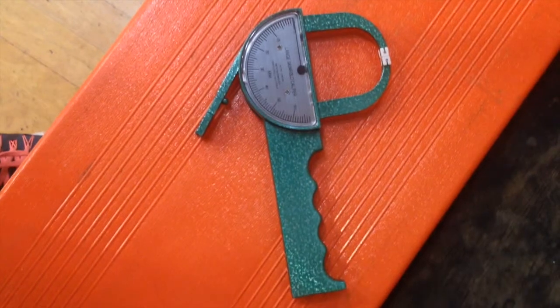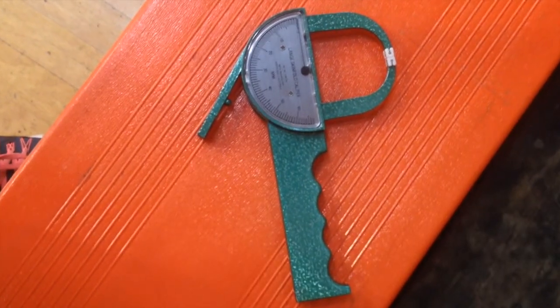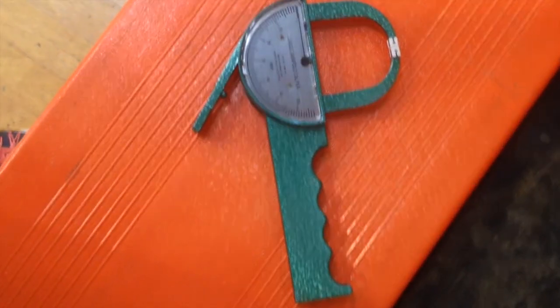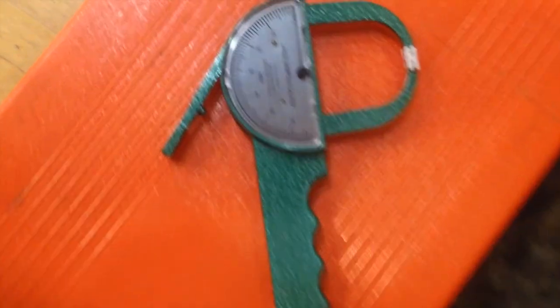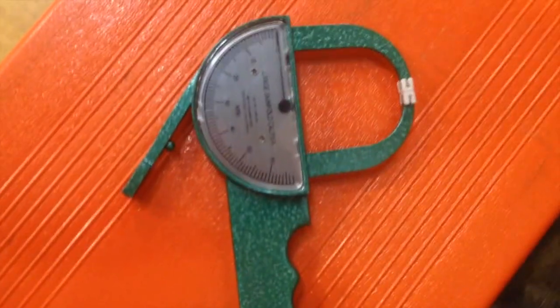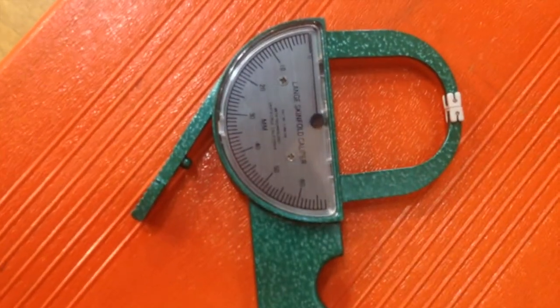This video will help you learn how to take skinfold measurements for both men and women. Anthropometric measurements such as the 7-site skinfold measurement do not provide highly precise estimates, but they do help in health and risk stratification.